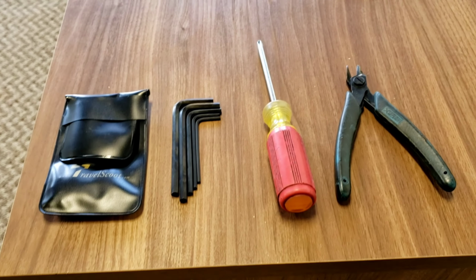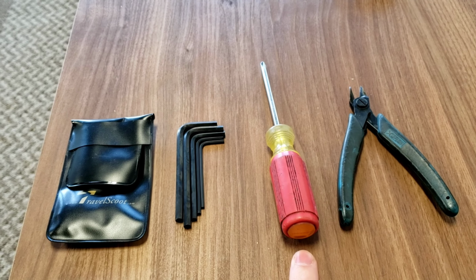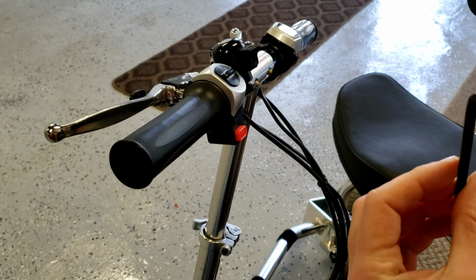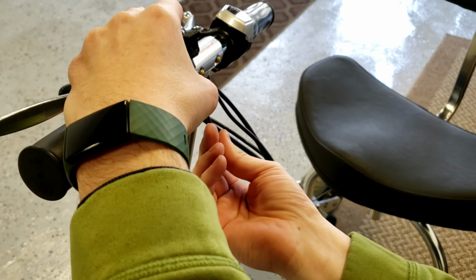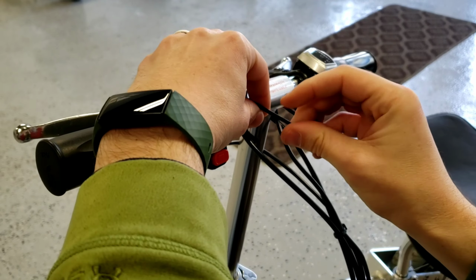All you need is the TravelScoot toolkit, a Phillips head screwdriver, and something to cut off a little piece of plastic. All right, so we're going to use a 5mm and a 3mm Allen wrench. We're going to use the 3mm Allen wrench on the bell, if you have it on there. This just comes off really quick.